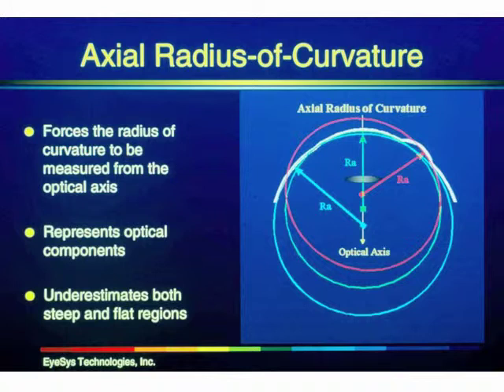So here we have a cornea that has a little defect on a little bump, maybe a Salzmann's nodule, on the right-hand side of this diagram here. And we're trying to find the best fit radius to map out this curve as opposed to the curve of the rest of the cornea.